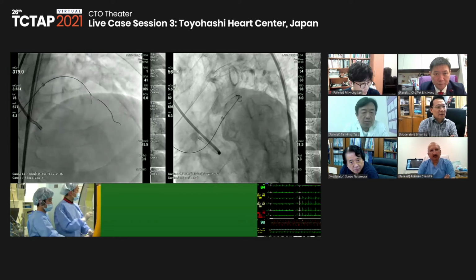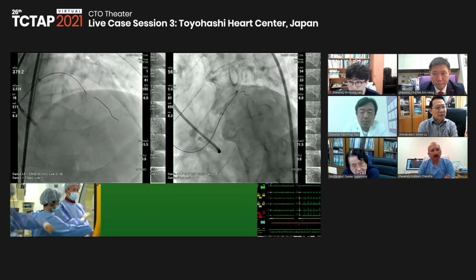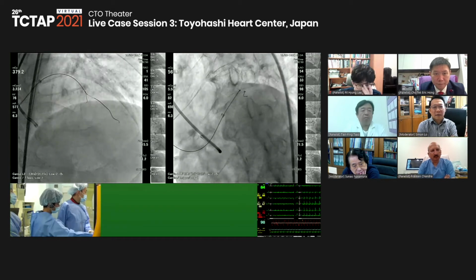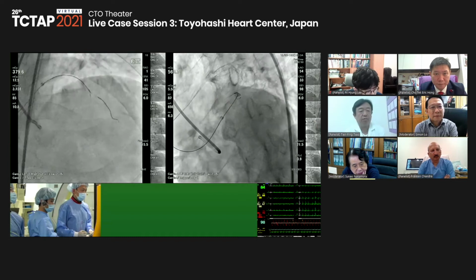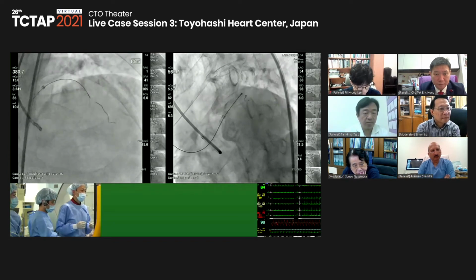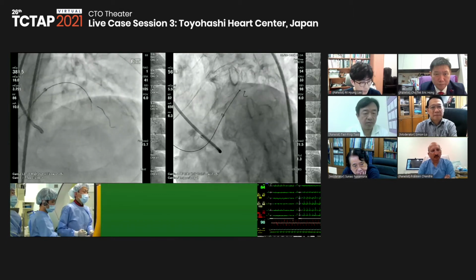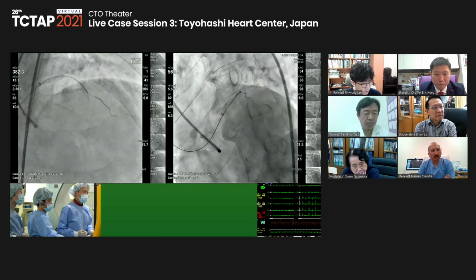Actually, in the CT findings, the CTO itself is not so hard. And also the real occlusion length may be 5 or 6 millimeters, I guess.